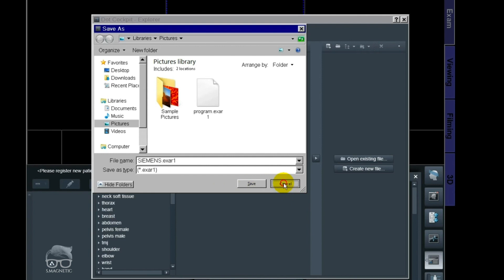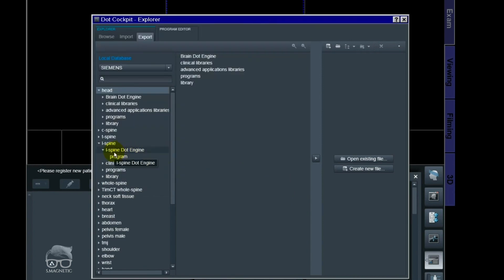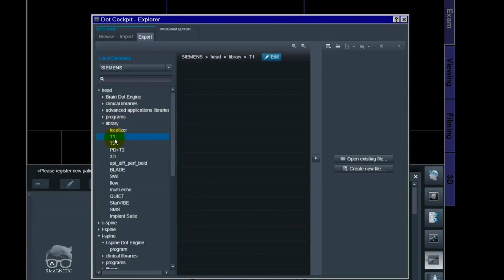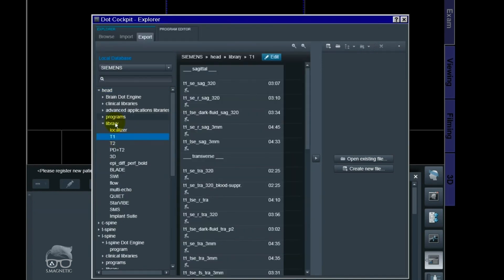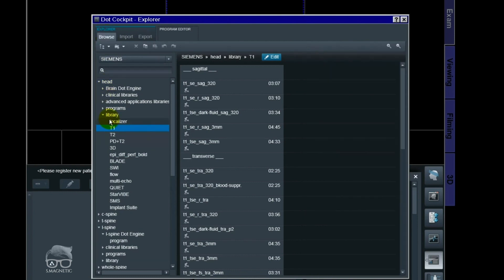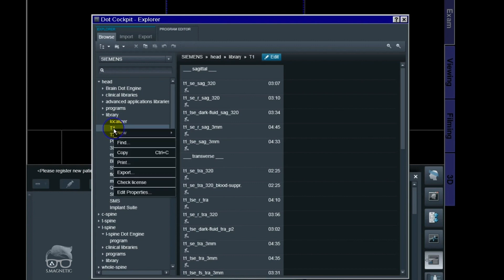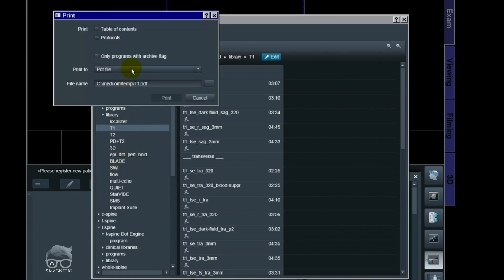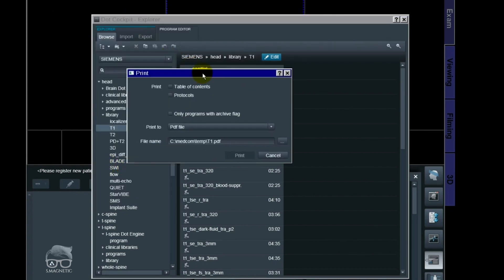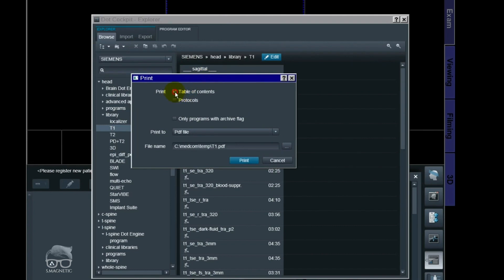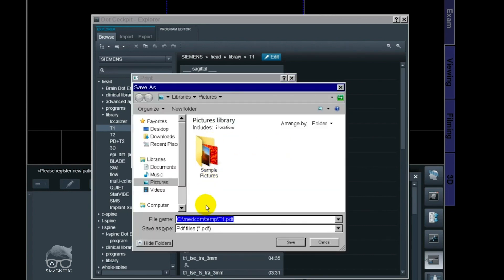And if you want to make a PDF file, let's say you want to make a PDF file out of that T1 right there, just right click and then print. There you go. Have on the table of contents and the protocols. And the file name, you can just save it wherever you want to your USB pen and just rename it to whatever you want.